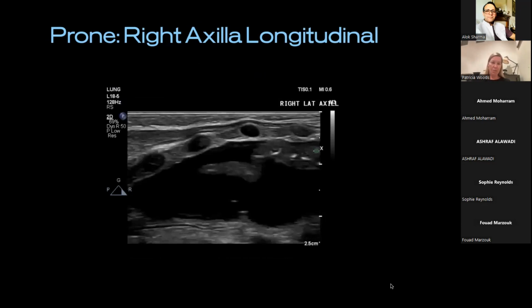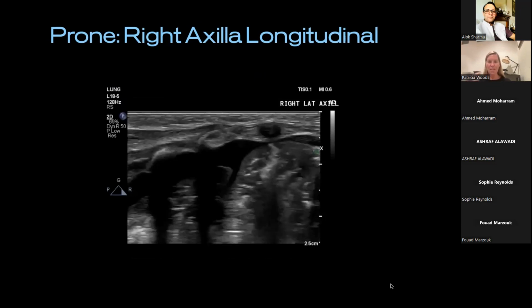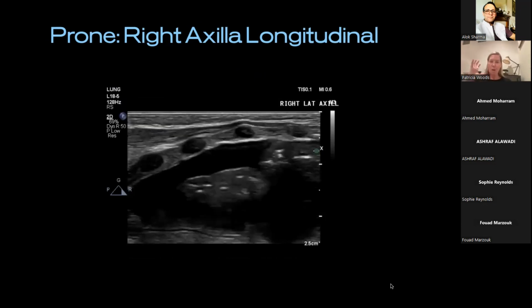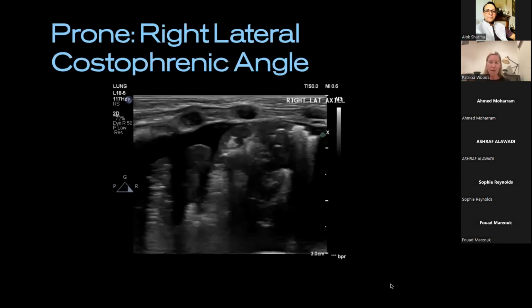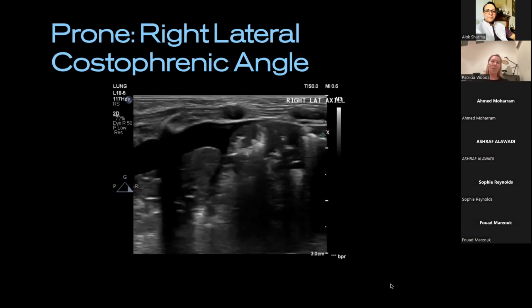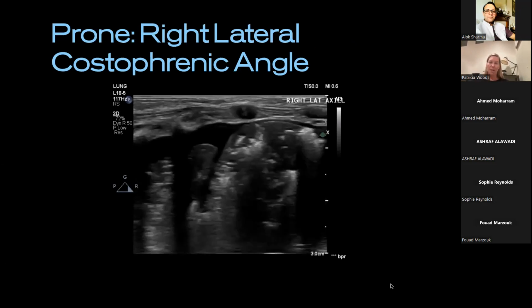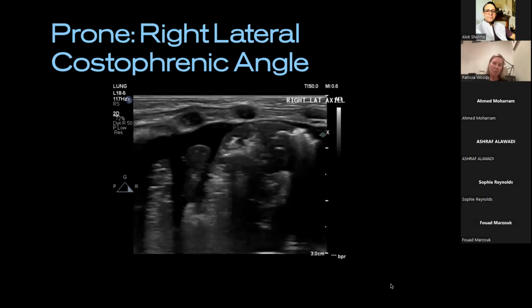I've got my little ribs there, the little fluid, and I'm starting to come. And this is where I might look at depth as well, just to give me a little bit more context of what we're looking at. And again, coming even further, like that costophrenic angle, you'll see that there's at least 2, if not 3 of those sets of that lung that you are able to observe with significant hepatization. And you can see that little diaphragm coming into place.